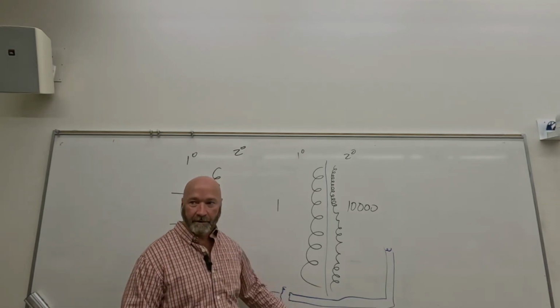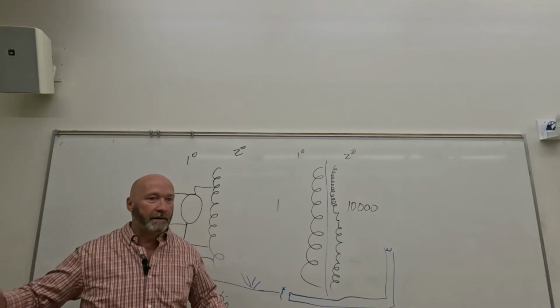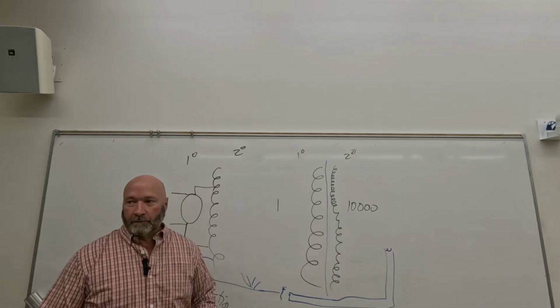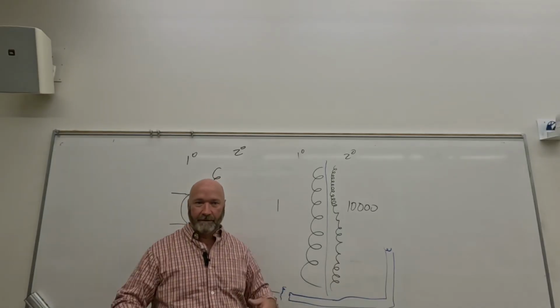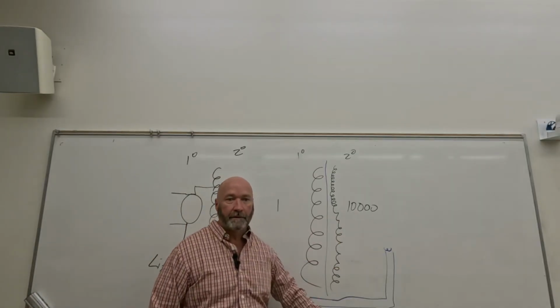Well, it's in the filament circuit. According to that diagram, it's in the high voltage circuit. But what does a filament transformer do? Decreases voltage to like 25 volts. So how could it be in the high voltage? You're going to get home and be thinking about that stuff. I'm going to simplify it: low voltage, high voltage, filament circuit, okay?